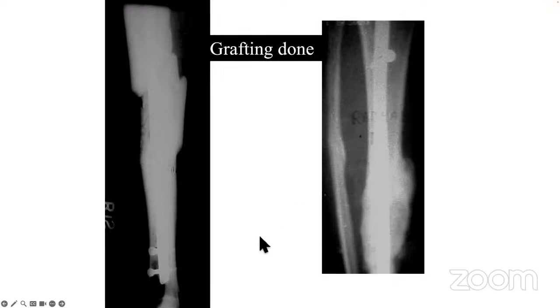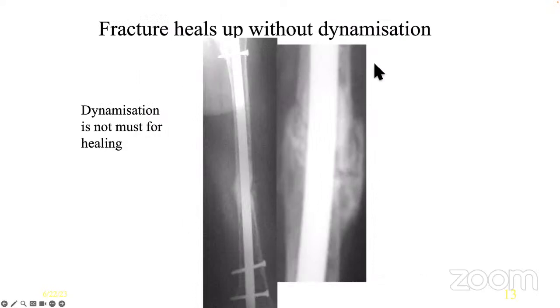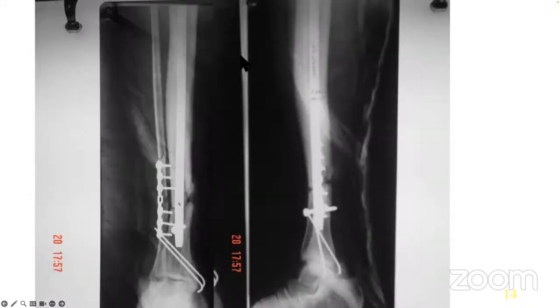Now you can see here, the fracture healed without dynamization also. So dynamization is not a must. You can see the majority of the time the fracture heals up without dynamization. Or if you put in a dynamic mode screw, then it heals up very well.